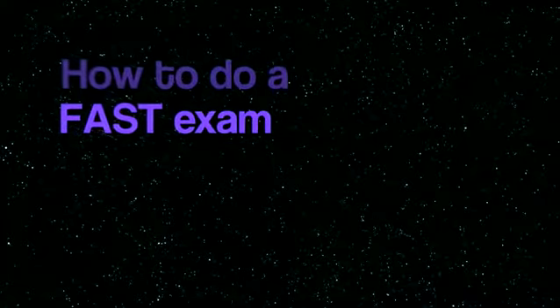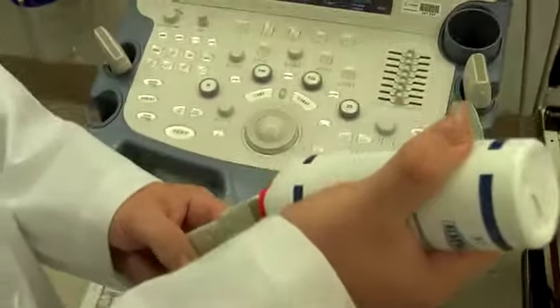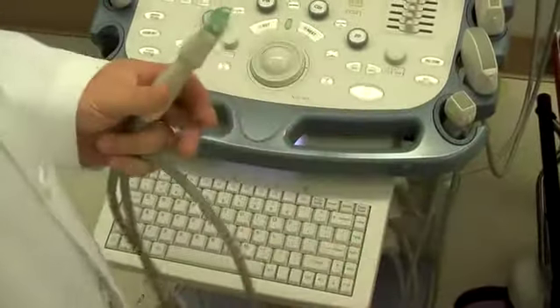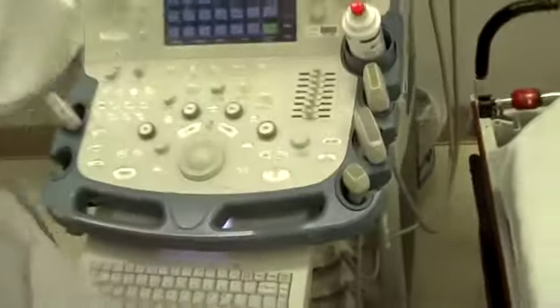So let's go ahead and get started. You're going to put a little coupling gel on the transducer probe. You always want to make sure your indicator, which is T for Toshiba, is always in the upper left-hand corner of the screen here.